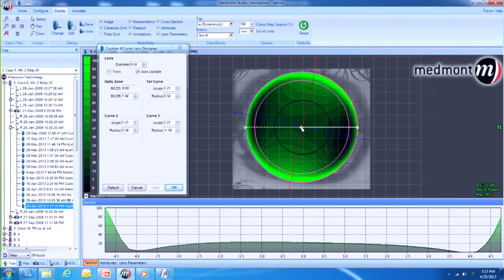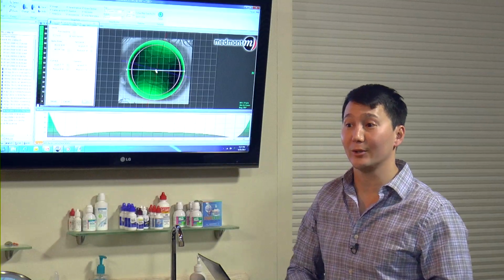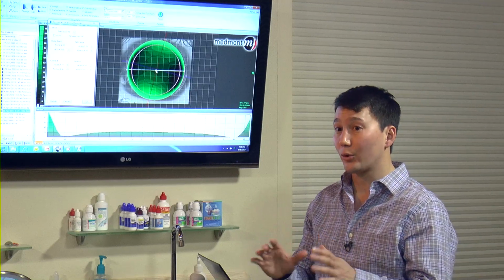The number one thing we teach our students at Pacific, the first thing you look at when you look at a fluorescein pattern of a GP lens is, does it clear the corneal apex? Does it appropriately clear the corneal apex? Is it bearing? Is it excessively lifting? So number one is, what have we done in terms of base curve to the cornea?